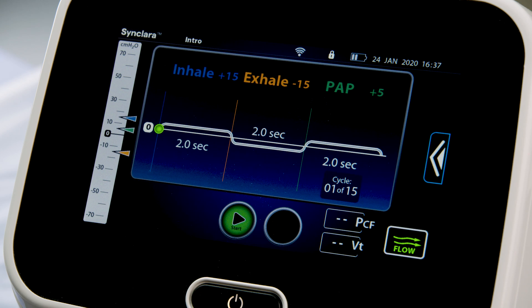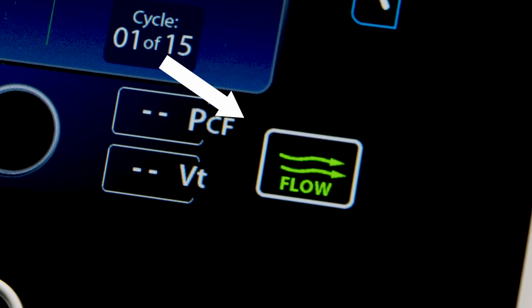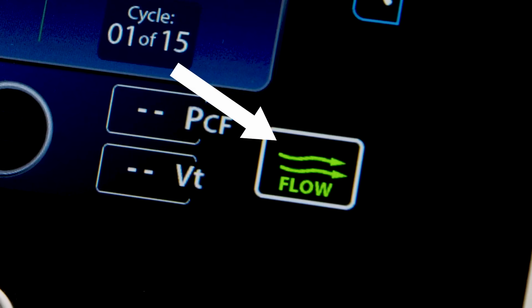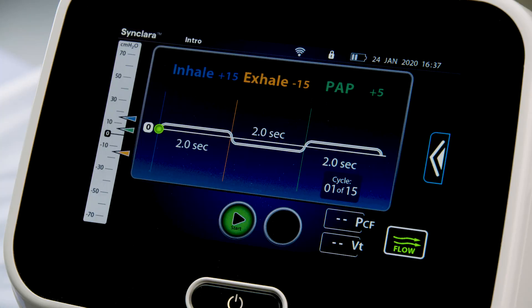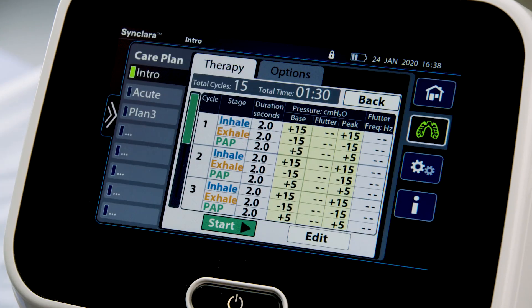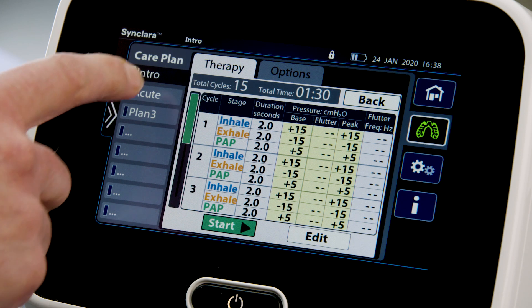When automatic is selected, the therapy preset last used on the control unit is automatically selected. If required, press the flow control to toggle between different intensities of air movement delivered during therapy. To continue with this therapy, press Start. Or, follow these steps to select another preset: swipe the Options tab left and press the Care Plan menu control, then select the preferred preset therapy plan.